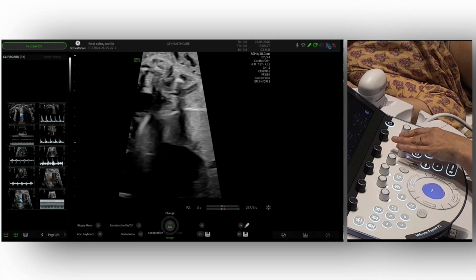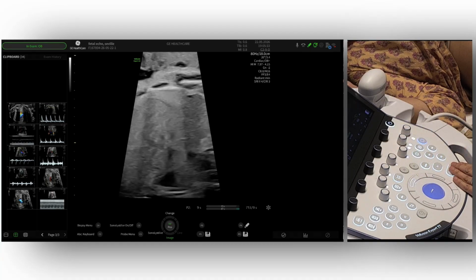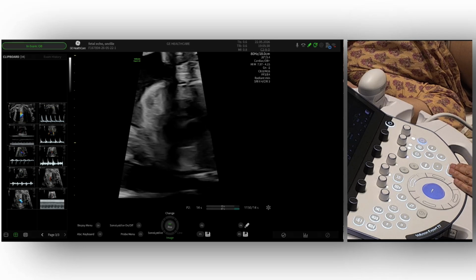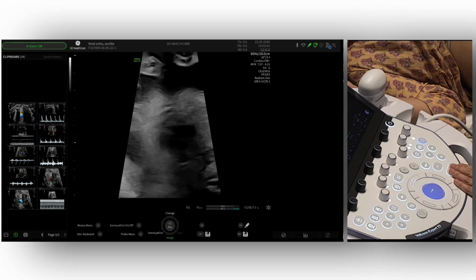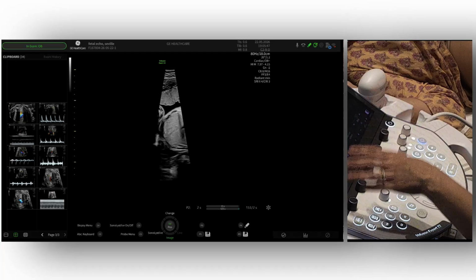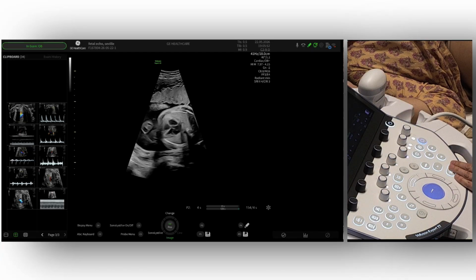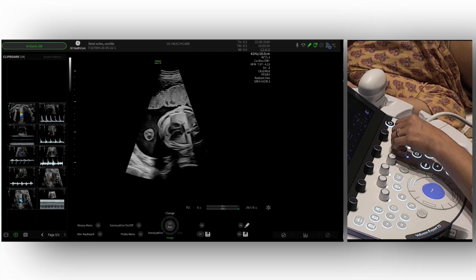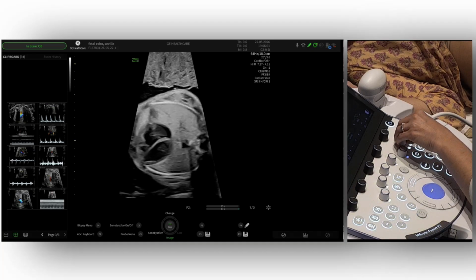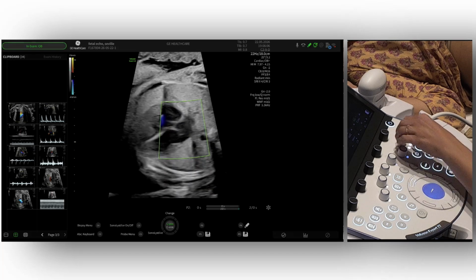And we can do it here, that's perfect, and the mitral and the aorta, it's one of the easiest ways to look at that. But sometimes, for example, when there are very fast tachyarrhythmias, this is not that easy. So I think it's important to know other places to look at it, not just the atrial and mitral and aorta, but to have other places where you can see this, that you get at the same time the atria and the ventricle. And for example, another way of looking at it is going to the veins, no? To the pulmonary veins, yeah?